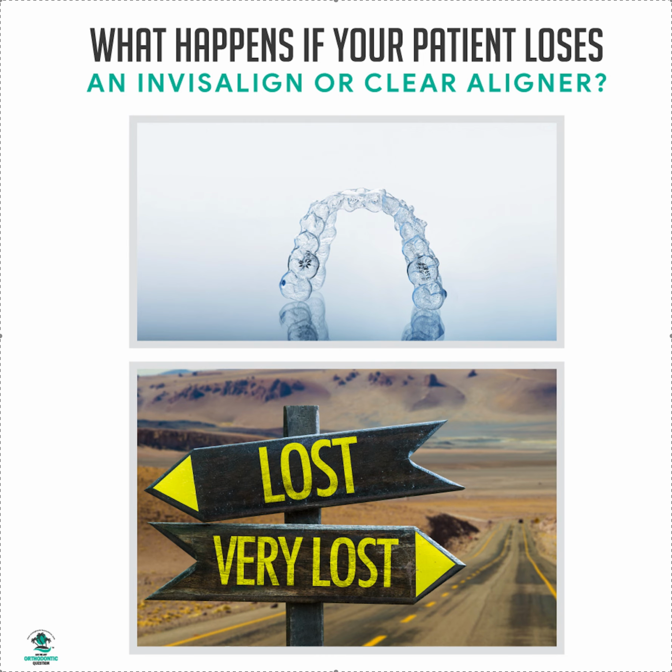So, first thing, it really depends on if you're doing what I tell you to do in all my videos. What do I tell you to do? If you watch all my Invisalign or clear aligner videos or take any of my courses, I always tell you make sure your patients are saving all their aligners in between appointments. They don't throw them away. They've got to save them. So if you saw them on aligner 5 and you're going to see them again on aligner, I don't care, 12, then they need to save 5 through 12 in a box.